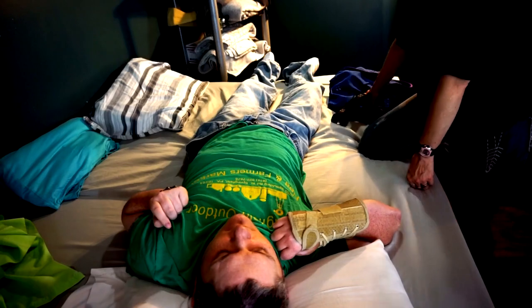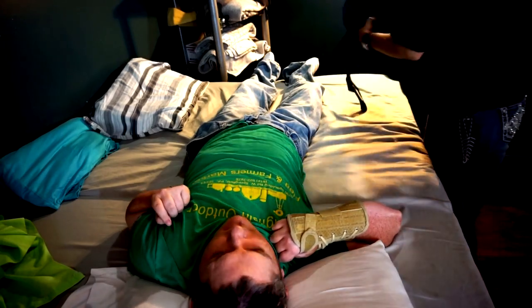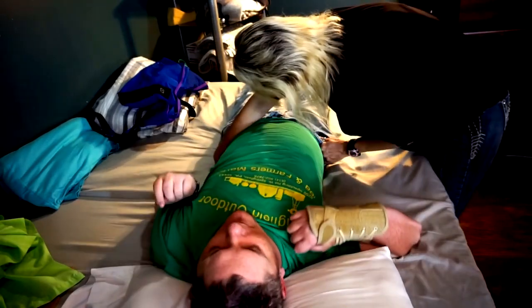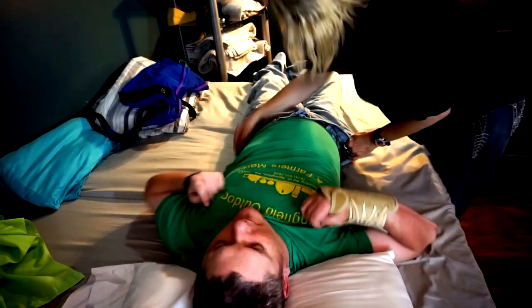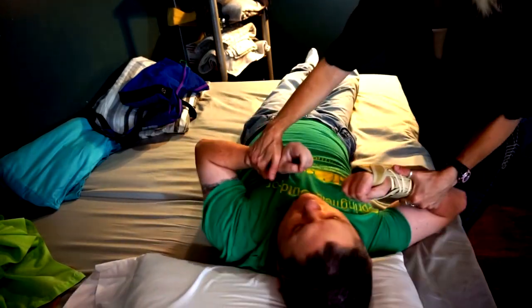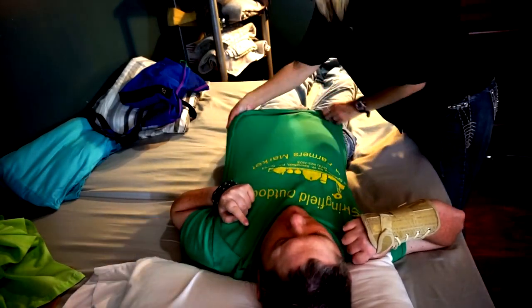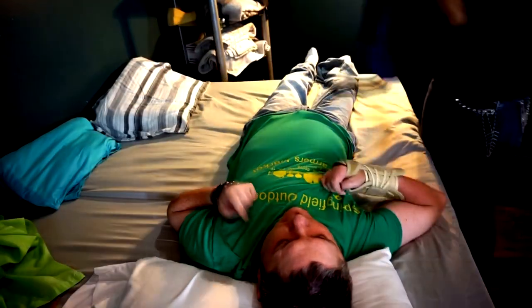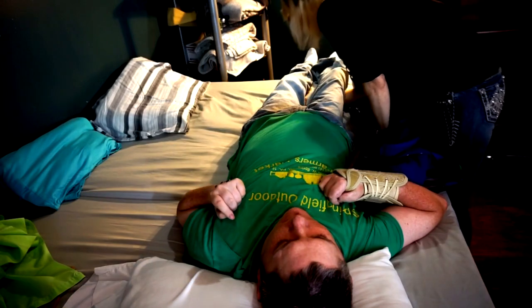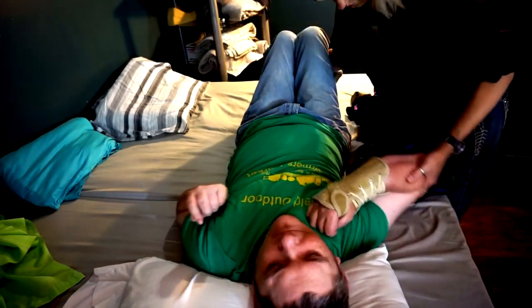I have my helper pull my pants a little bit straighter and give me some room in the crotch area. I give a couple tugs toward the end of the bed — the Hoyer doesn't really reach that far into the bed, so I have to tug toward the end.